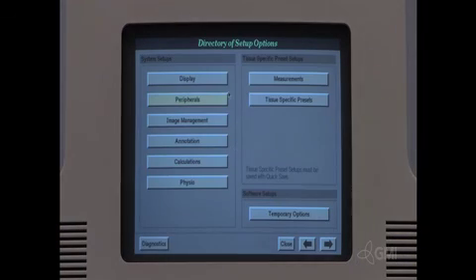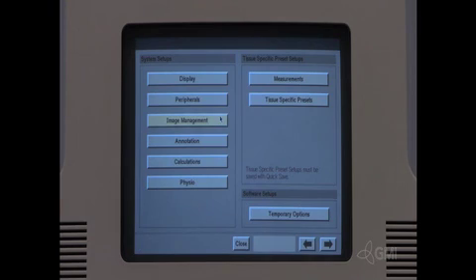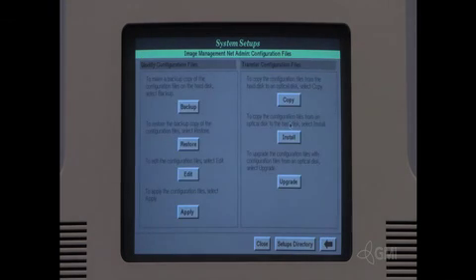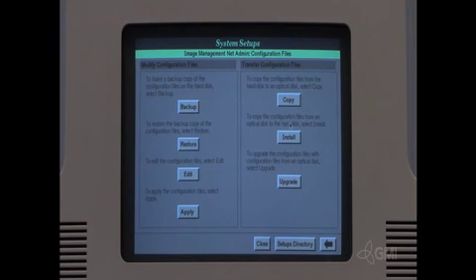Press the setup button. Select image management. Select configuration files. Select install. Follow the prompts to install the network configuration.